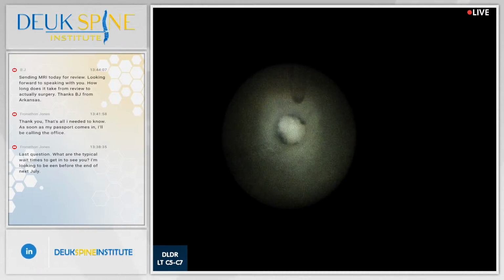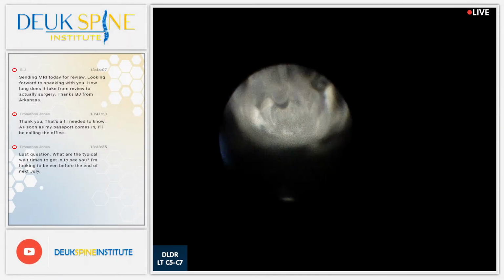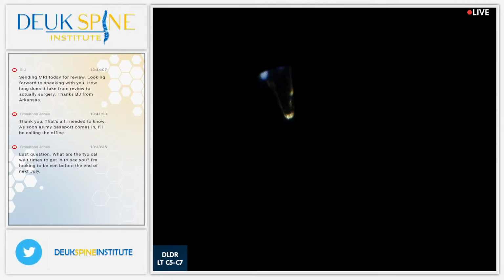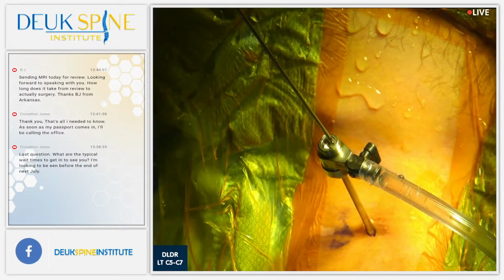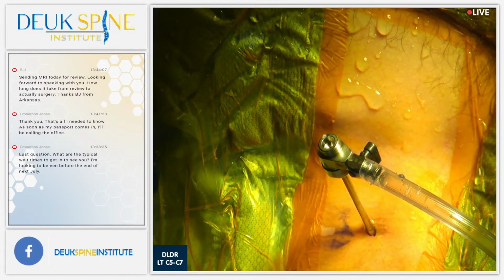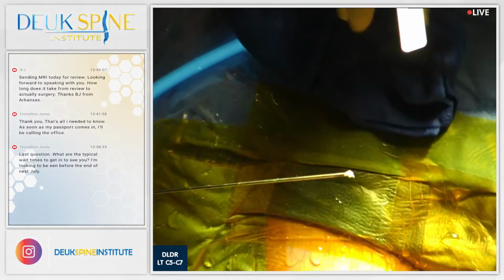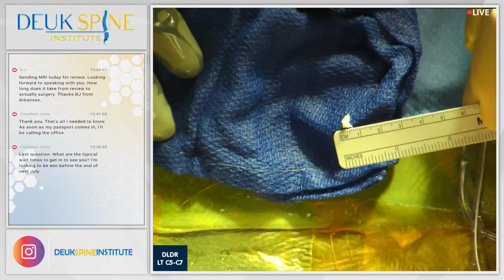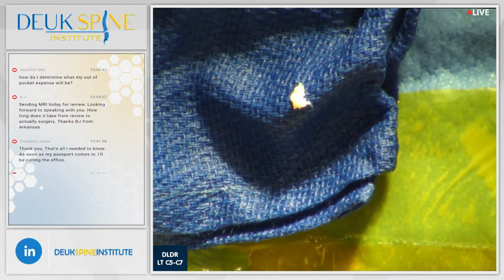All right, my gosh, there's so many herniations here, guys. This is the last one, I think. Hopefully. I keep saying that and then I find more. But I just want to make sure we get as many as we can out. Remember, we're not going to get 100%. There it is right there. Henry, you see that? Yes, we do. It's kind of hard on that background, but you can see that. Perfect. That's a good size one. That's probably the biggest one. It's about 5 millimeters. It's like a little asteroid.